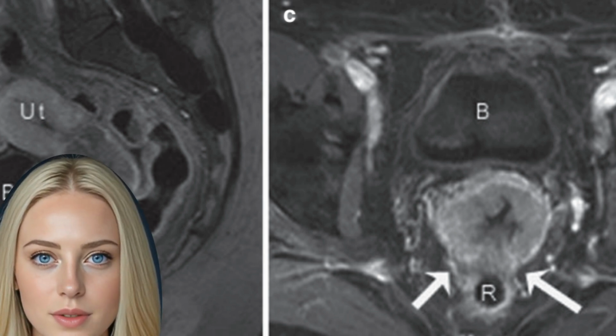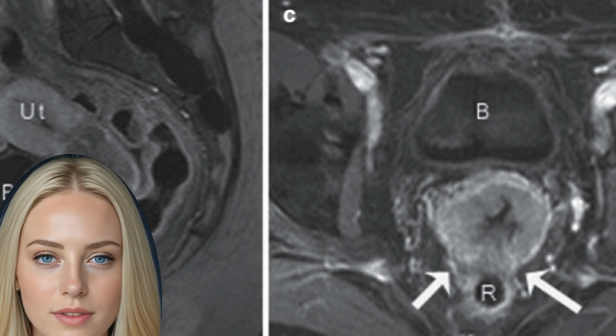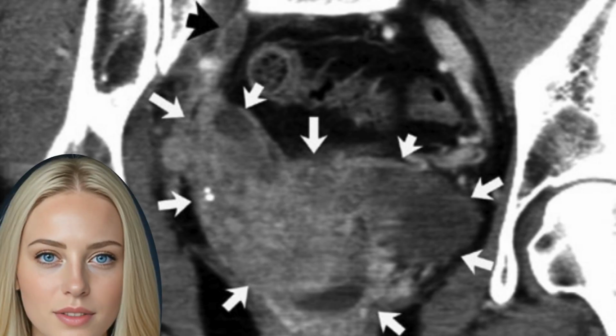In rare cases, the tumor is isointense to the surrounding tissue in the T2WI or too small in diameter, as this may be residual tumor tissue after curettage. In these cases, DWI or CET1WI with fat saturation is relevant for tumor detection.